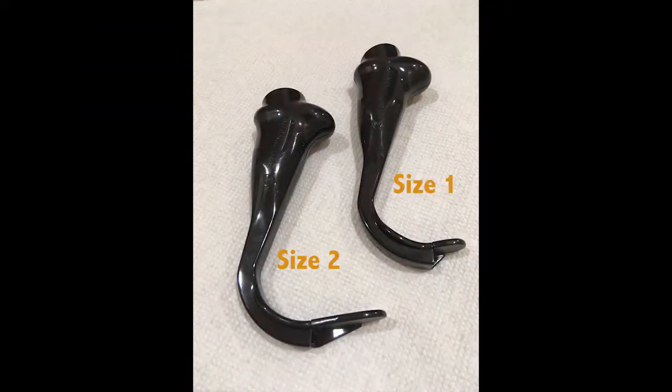The range of pediatric GlideScope blades not only vary in size for different age patients, they vary in shape. The change in shape compensates for the fact that the angles of the pediatric airway and the depth of the larynx in relationship to the structures of the neck change with age. Compare this size 2 blade on the left with the one on the right.